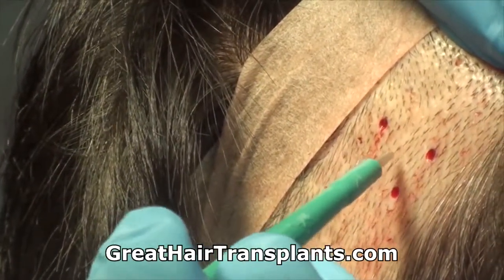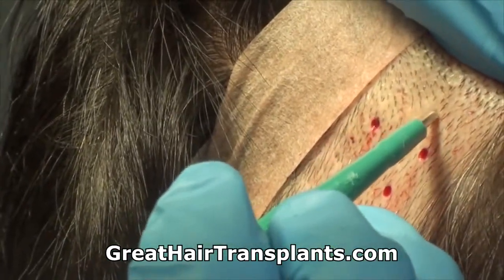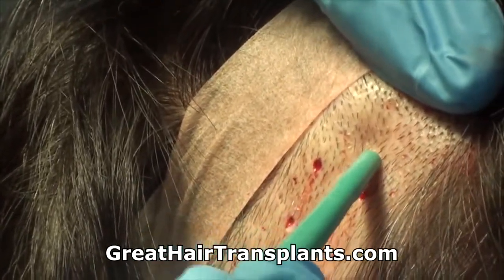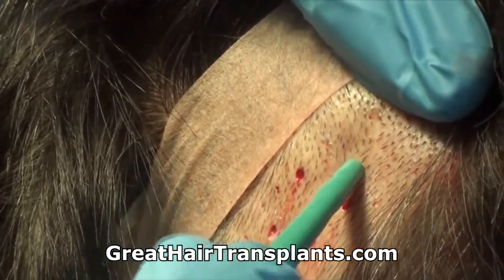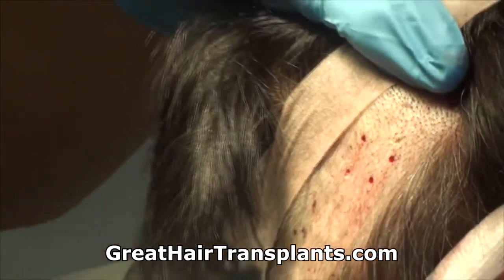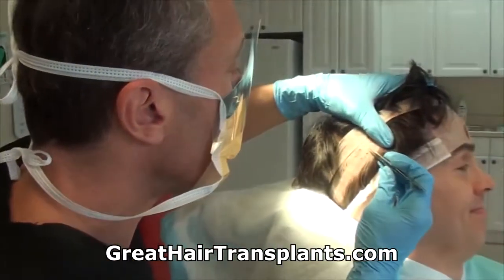Let's try this little guy right here. Right. Well, how about this guy? Let's get this guy. Okay. So this is what they would have to do for you. Pull these out one by one. Okay, just like that. And you're going to tell me going in like this, you're going to be able to get good grafts? Well, I'm showing you how you don't get good grafts.